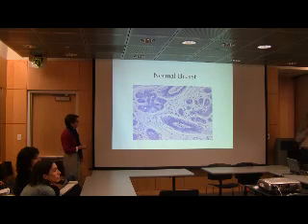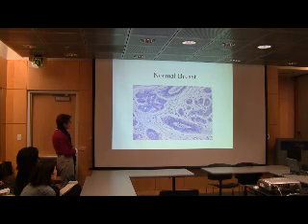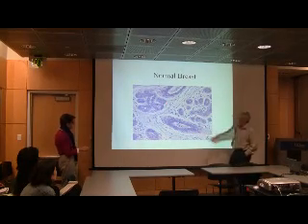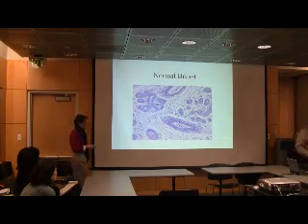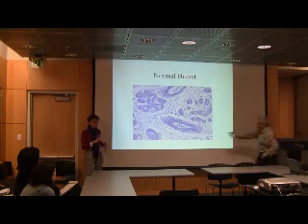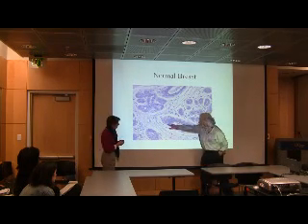Sorry, what are the cells inside the duct? Inside the duct, like in here. Okay, so let's take this one. There are two main layers of cells. There's this inner layer of cells here. Those are the epithelial cells. And there's an outer layer of cells that are a little bit more elongated. Those are the myoepithelial cells. So can you see that? Like here, here, here.